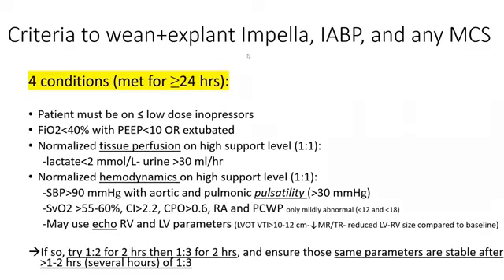So the criteria to wean and explant balloon pump are the same as the criteria to wean and explant Impella and any other mechanical circulatory support. I have shown that slide before with Impella. So to consider weaning the balloon pump, you have to meet those 4 criteria. And balloon pump, you can keep it for days or weeks for as long as the patient needs it. And in patients awaiting transplant, we have kept it for weeks. Evidently, the longer you need to keep it, the more you should think of switching to axillary balloon pump, which will be the subject of my next talk.